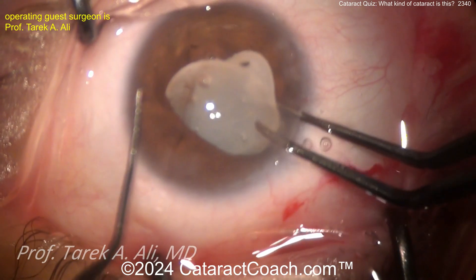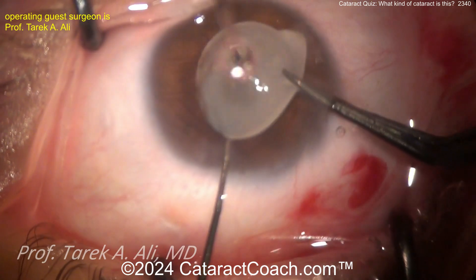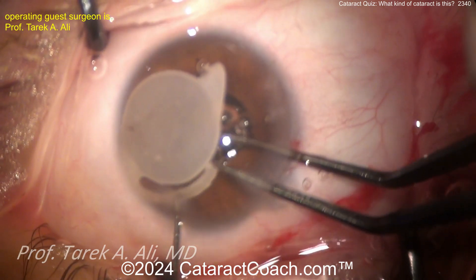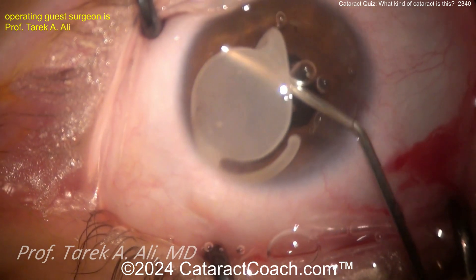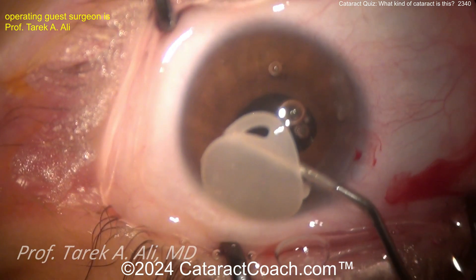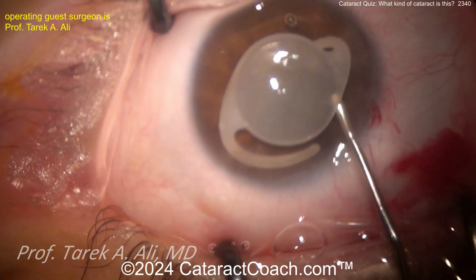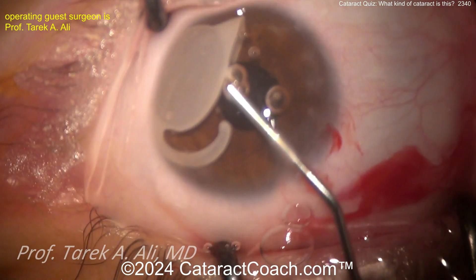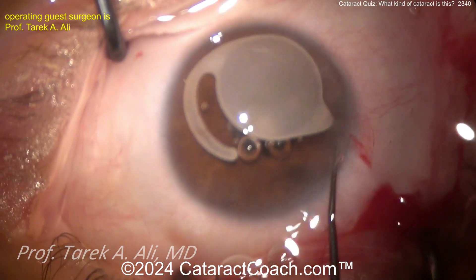It is completely opacified — wow, the whole thing is completely opacified. Do you want to do a twist-and-out technique? You could, but remember if this is a calcification, that can actually make the lens more dense or hard, kind of like a rock. So you may have a hard time folding it in the eye. Perhaps it's easier in this case to free that haptic and cut it. This is why I like to do a good viscodissection and separate the bag from the IOL completely before bringing it out.